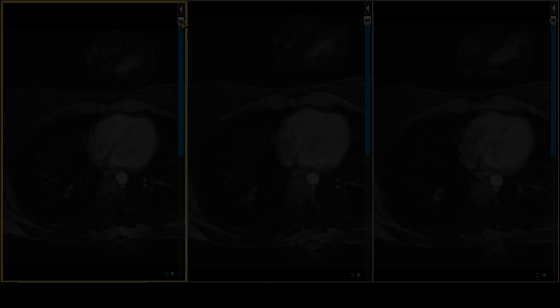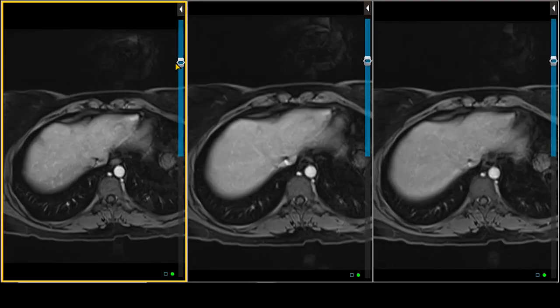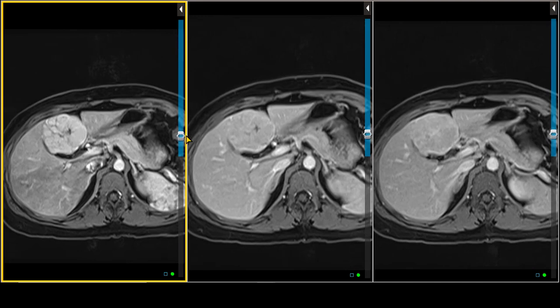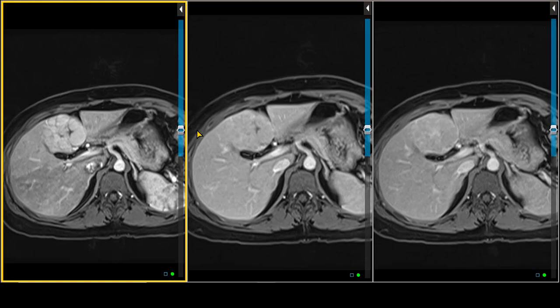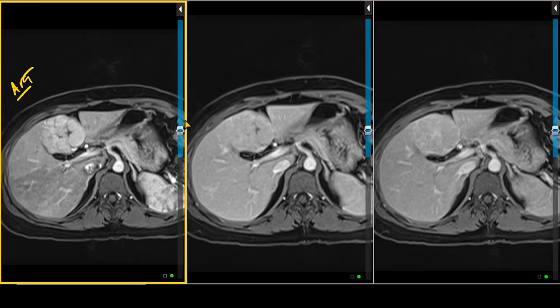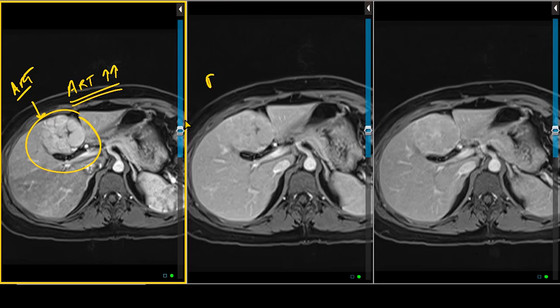Moving on to post-contrast imaging sequences, we have the arterial, portal venous, and equilibrium phase images. In the arterial phase, the lesion has pretty homogeneous arterial hyper-enhancement. On the portal venous phase image, the lesion is somewhat iso-intense to slightly hyper-intense with respect to liver parenchyma — some portions look very similar to liver parenchyma while some portions remain slightly brighter.